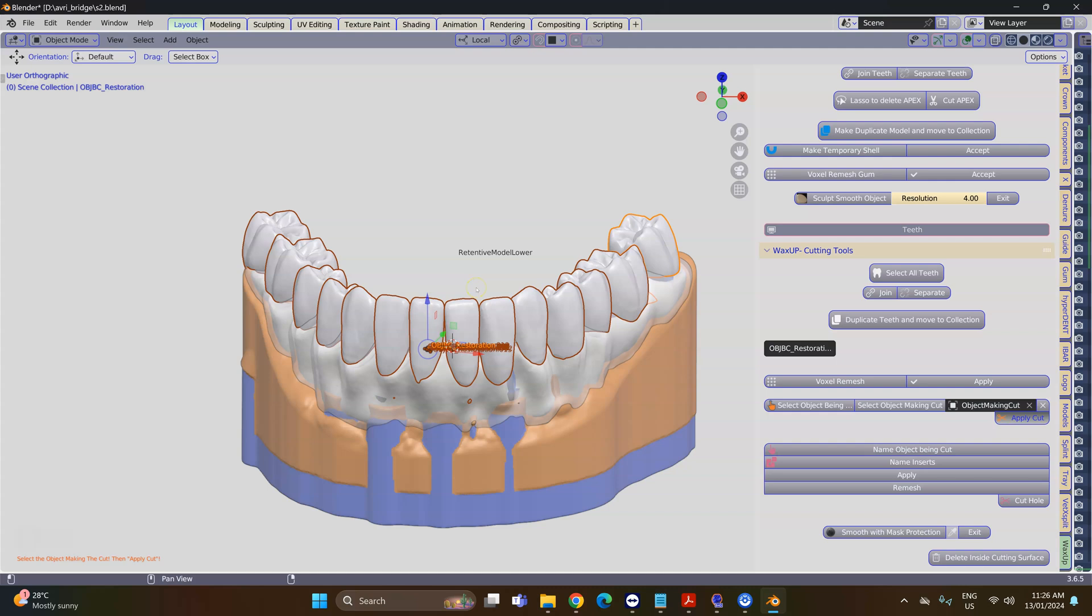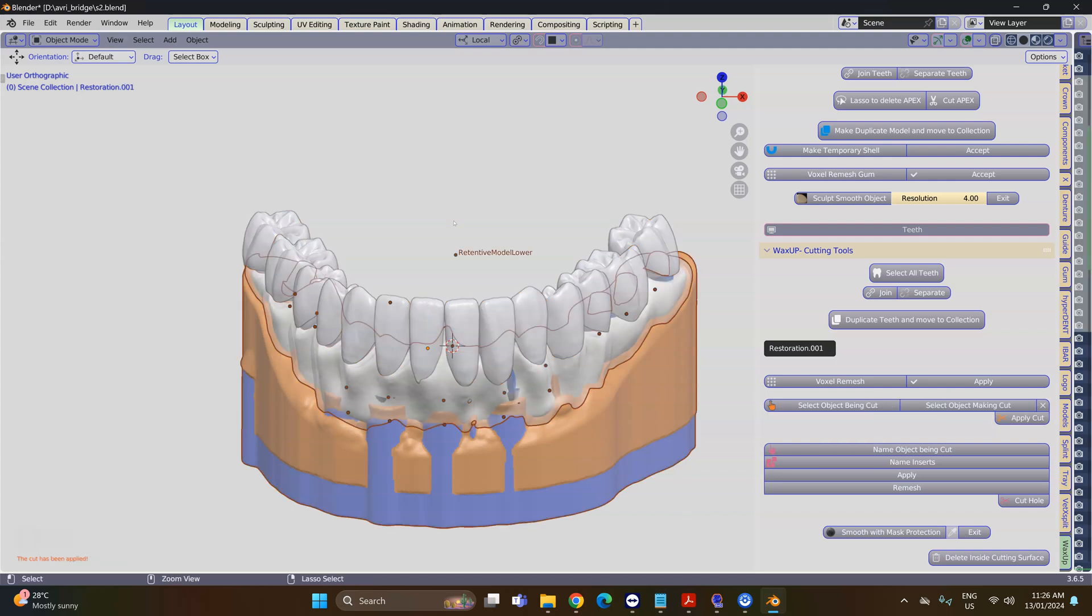Excellent, so they've all been cut. We're going to go Ctrl+I and hide just to see that everything is okay.